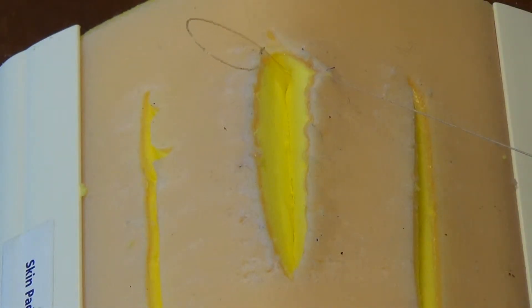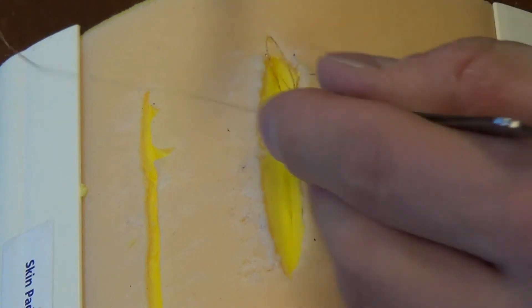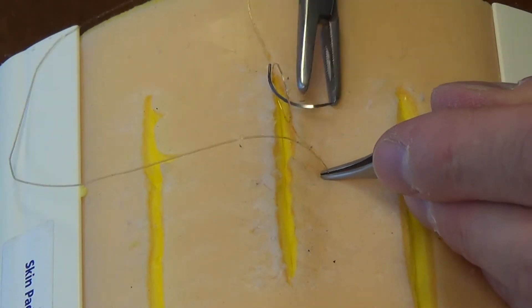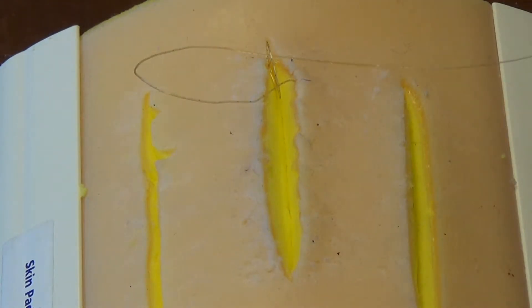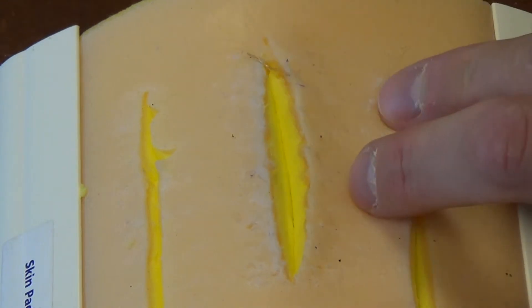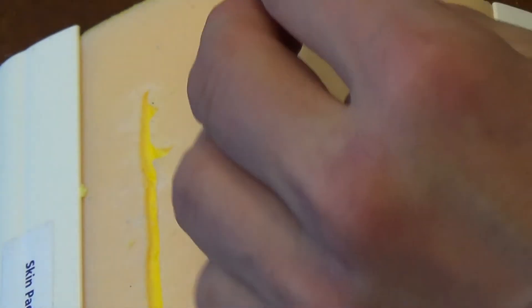If I pull the quill, that loop starts to get small. So I'll go ahead and pass the needle through the loop. It creates a closed loop and fixation. And now I'm ready to suture.